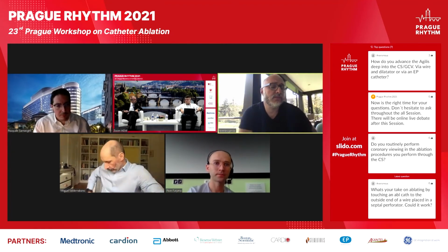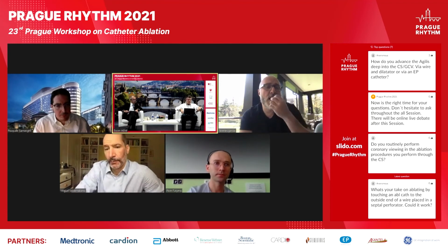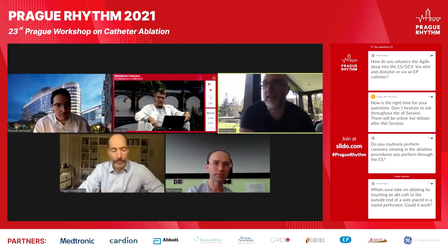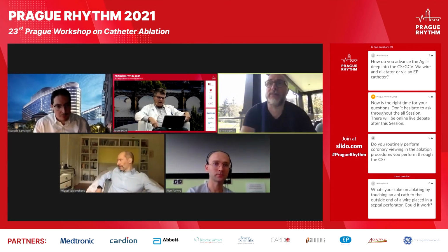Okay. I have one more technical question to Fermin, and the last question for him. What is your strategy for ablation at sites with high impedance and low cooling, like in a distal vein branch? Yeah, that's the main limitation for ablation within the venous system. There's not much you can do, to be honest.